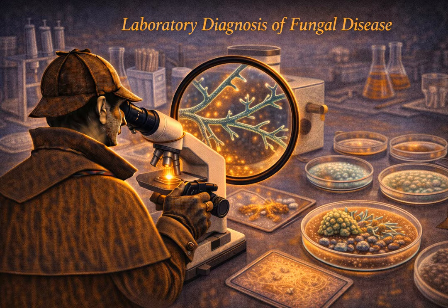What about antigens? Looking for the smoking gun of the fungus itself. Antigens are the gold standard for rapid non-culture diagnosis. We are actively detecting shedding parts of the fungal cell wall or capsule in the body fluids. Let's run through the big four because these tests save lives every single day. Number 1, cryptococcal antigen or CrAg. This is an absolute superstar test. It specifically detects the glucuronoxylomannan polysaccharide capsule of Cryptococcus neoformans.